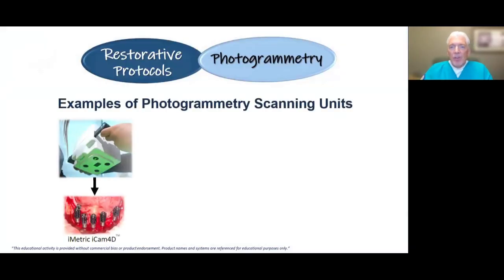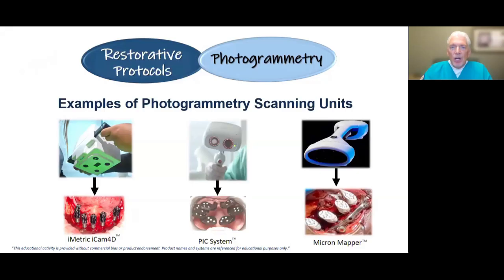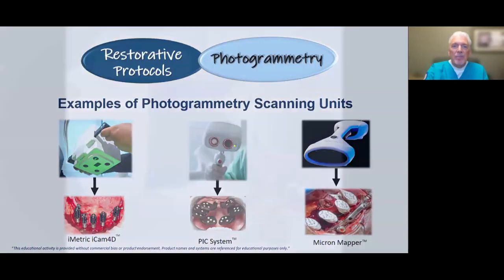So again, for those of you that might be new to understanding what photogrammetry looks like, these are the scanning units, some of the common ones. There are other ones out there. Just because I'm not showing them doesn't mean that we don't work with them or don't recommend them. But these are some of the more common ones that we are seeing coming into our laboratories.